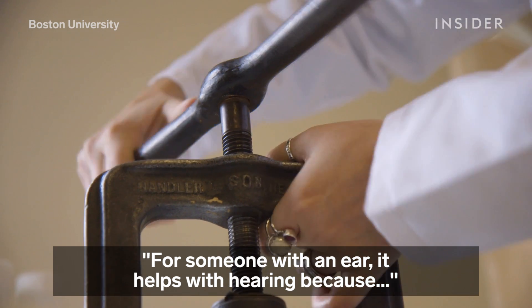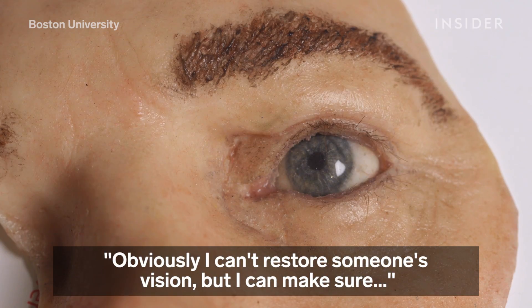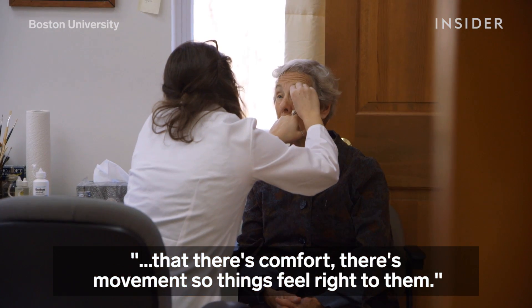For someone with an ear prosthetic, it helps with hearing because it helps make sure that the sound directs properly. Obviously, I can't restore someone's vision, but I can make sure that there's comfort, there's movement, that things feel right to them.